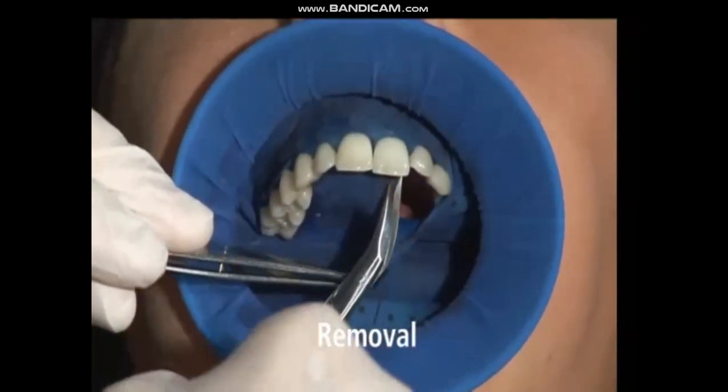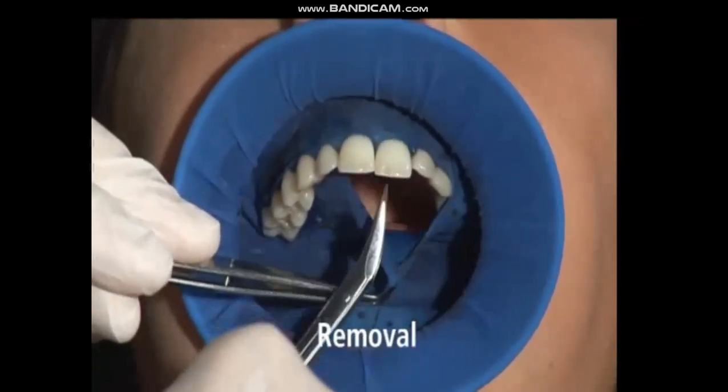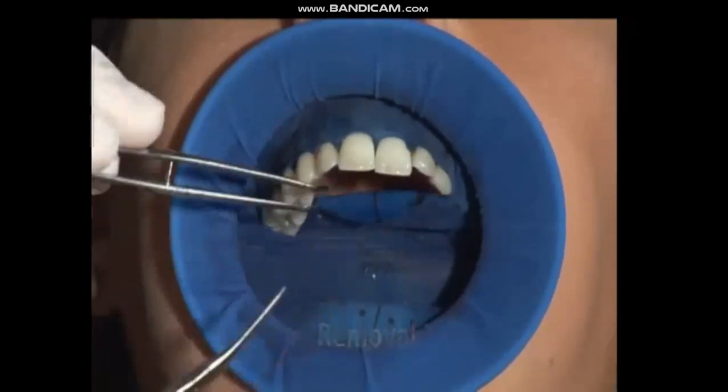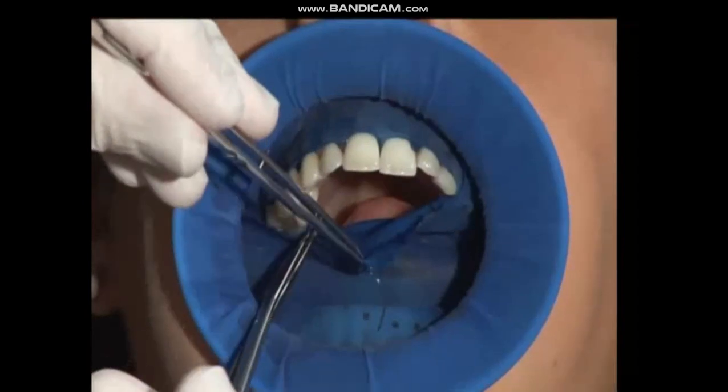For easy removal of the OptraDam, pull the interdental septa with the forceps in a lingual direction out of the interdental space and cut them with a scissor.